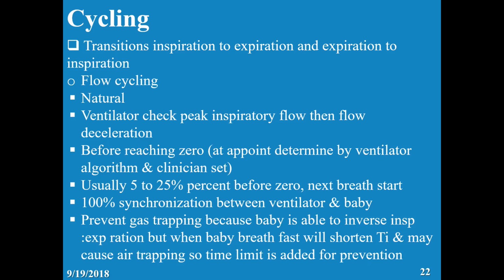While in this, it is controlled by the baby, because it depends on the flow. It depends on the percentage of remaining flow. And therefore, the patient can clear the air, because he can prolong the inspiration as much as he or she wants. It can be shorter, it can be the same, and it can be prolonged.